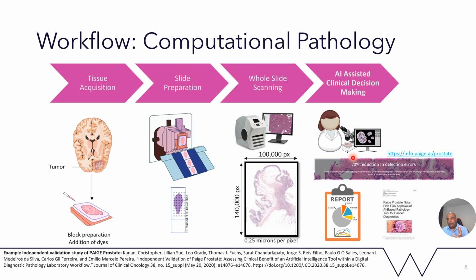So once that goal is achieved, we can then use just the machine learning model and replace conventional testing of receptor status with this image-based whole slide image machine learning model, which would help us get more efficient and hopefully solve other problems that we currently don't solve with imaging. So can we solve MSI prediction with just imaging, or do we really need those MSI tests for this purpose? That is a question we are going to investigate.